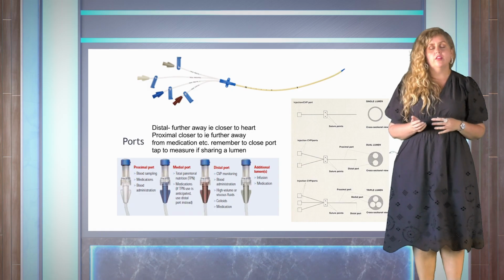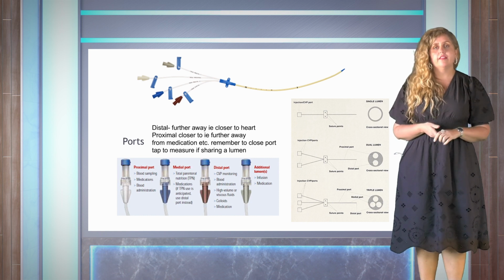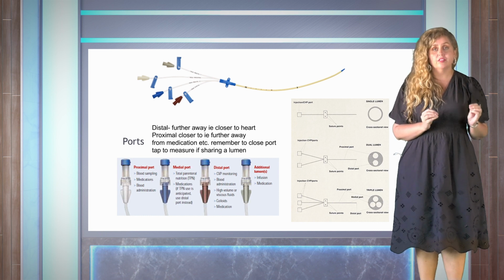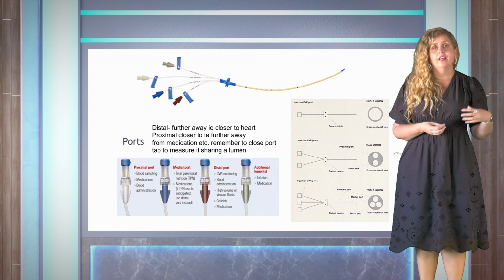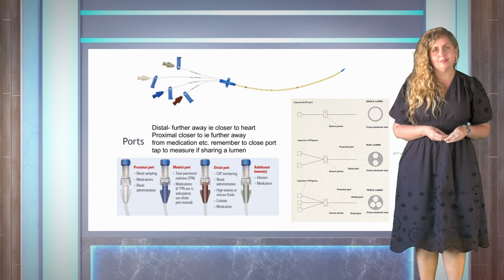Our other lumens can be used for maintenance or inotropes, which we group together, or sedation, but ensure that you don't put any fluid boluses on these, because it will act as an inotrope or sedation flush, and you'll get a bolus delivery of those agents.